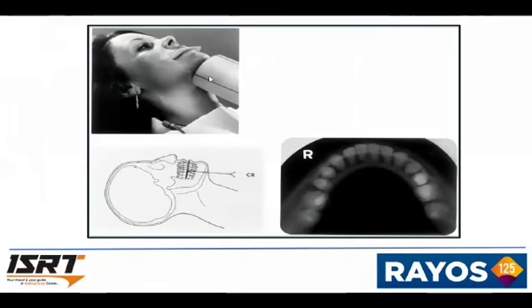So these are called the mandibular occlusal. It can be either a true occlusal or an anterior occlusal. Here we have taken a true occlusal to get the floor of the mouth. Usually this is indicated if there is any salivary duct cyst or salivary calculus. So this can be seen if it is evident in the floor of the mouth.